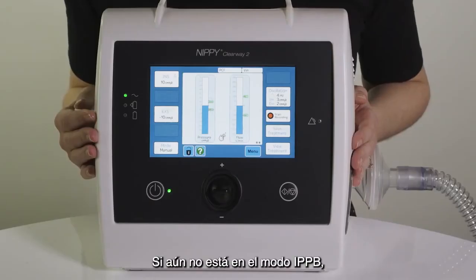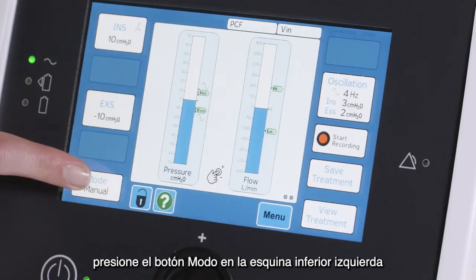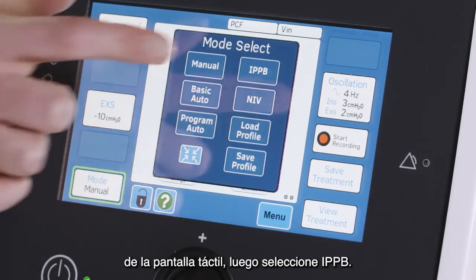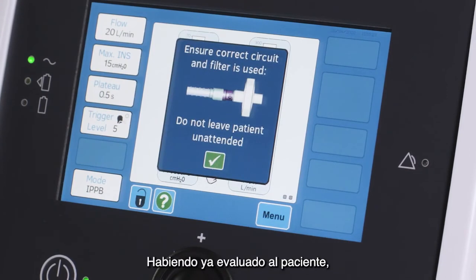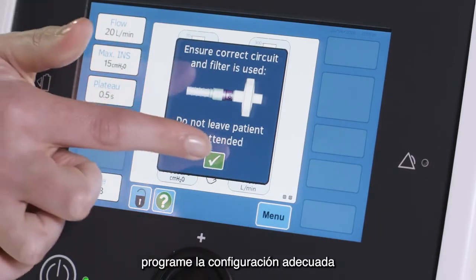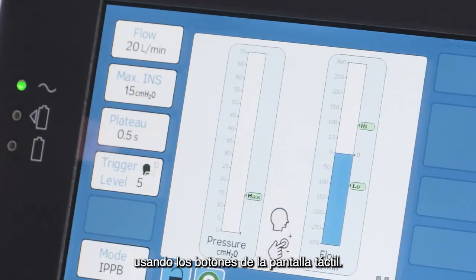If not already in the IPPB mode, press the mode button in the bottom left corner of the touch screen, then select IPPB. Having already assessed the patient, program in the appropriate settings using the touch screen buttons.